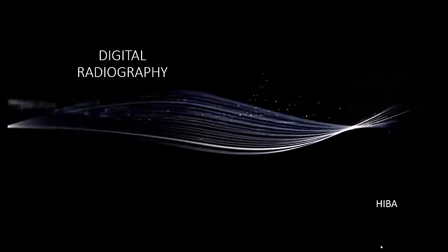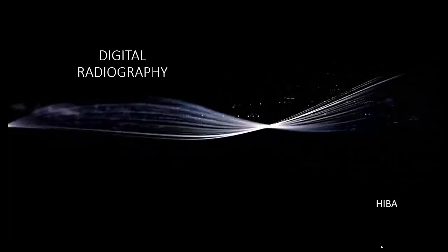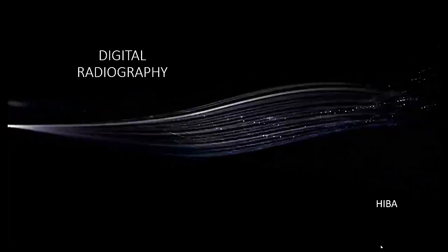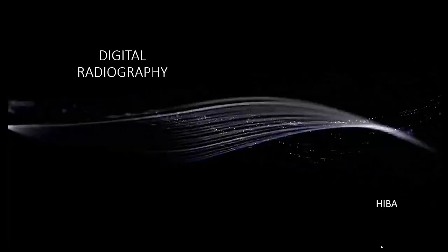So today's topic is digital radiography. We know that radiography is an art and science of recording images produced by X-rays on an X-ray film. Till the past decade, the conventional film screen system was the most widely used and accepted method of recording images, wherein the film acts as an image receptor, display medium, and a source of permanent record.